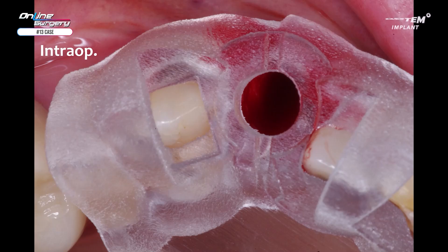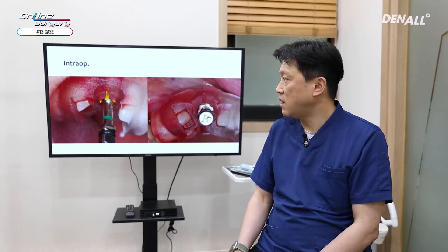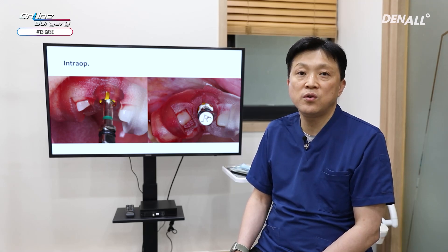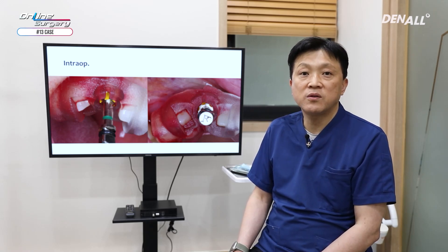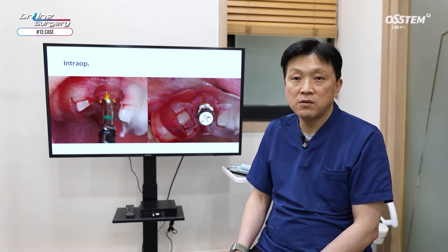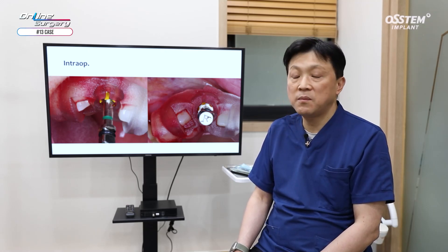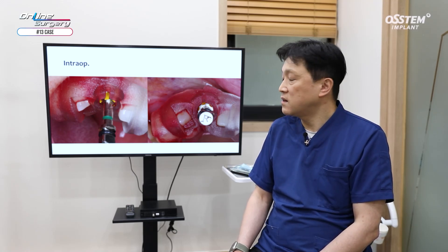The guide was adapted, and the fit of the slot was checked to determine the fit of the guide. Following the conventional one-guide process, the implant was placed. Initial drilling should be done following the guide hole — this is most important. One guide path drill was used twice: a 7 mm and a 13 mm path drill. The 7 mm drill was used first, then the 13 mm drill up to the marking point, meaning drilling was done up to 10 mm. You need to form the initial drilling hole first, and then further drilling should be performed.